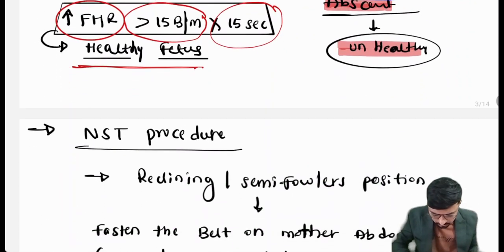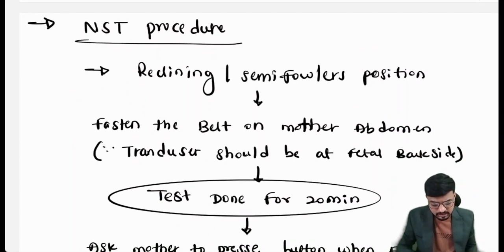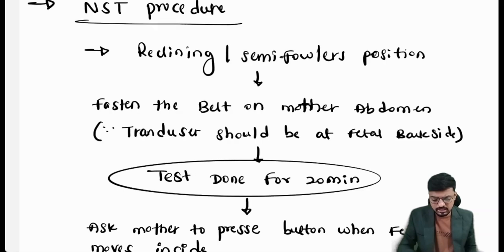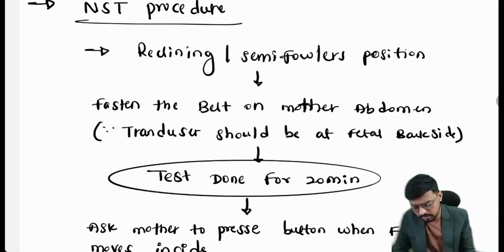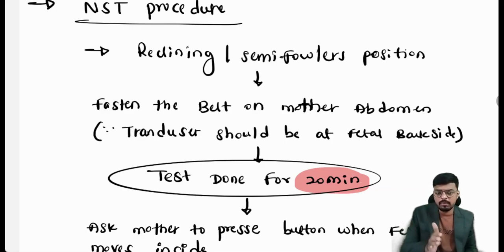So we have studied all the interpretation of the NST. Then comes the actual procedure we have to follow during the non-stress test. First we have to tell the mother that this is a continuous 20 minute procedure. You should not leave the machine for the duration of the 20 minutes.